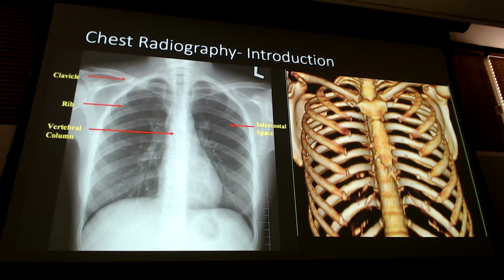What you'll see in medicine sometimes is, well, how do we get this? Well, easy. This is after the patient got a scan done. This doesn't harm the patient at all. It's not an extra scan. It's just done with the data that's already there. So somebody was probably toying around with the 3D remodeling and said, hey, look at this cool thing I got in the chest, and it got published. But very rarely are these really useful, except maybe in very specific orthopedic surgical examples, and it doesn't get done very often.